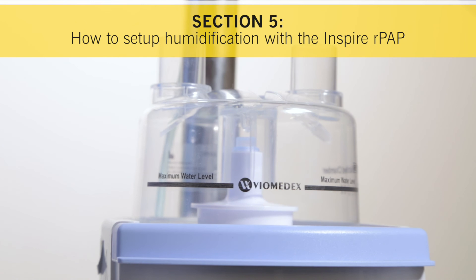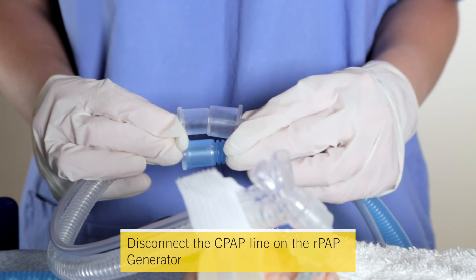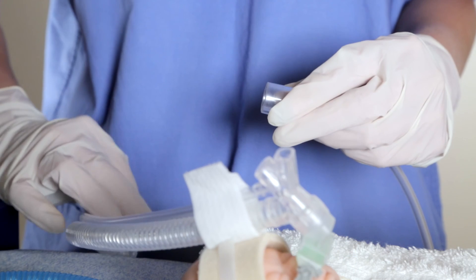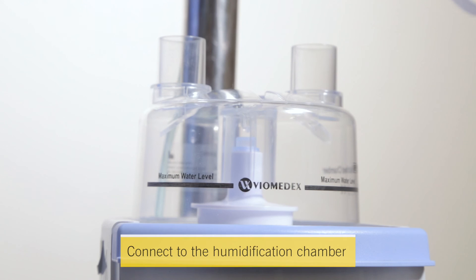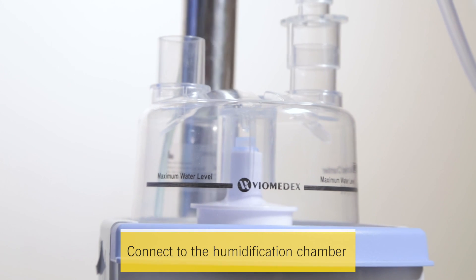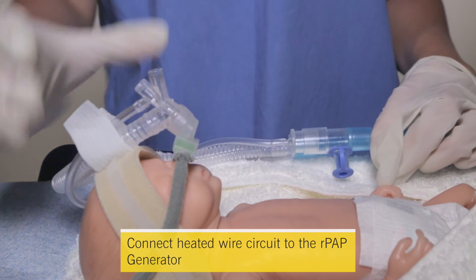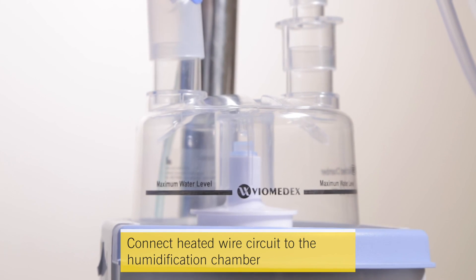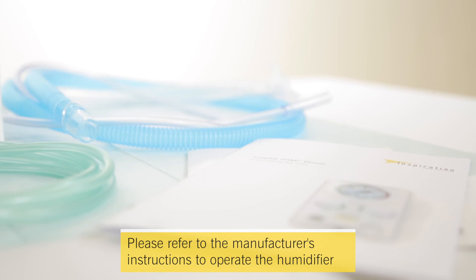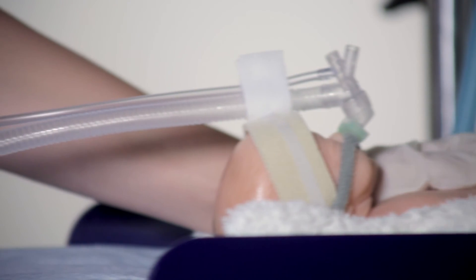Section 5: How to set up humidification with the Inspire RPAP system. If humidification is required, disconnect the CPAP line at the mid-circuit connection point and attach the clear connector to the humidification adapter included in the pack. Connect this to the humidification chamber. Then connect the proximal pressure port of the heated wire circuit to the RPAP generator at the same mid-circuit connection point, and the other end to the humidification chamber. Please refer to the manufacturer's instructions to operate the humidifier. The infant is now ready to be transferred safely to the NICU.